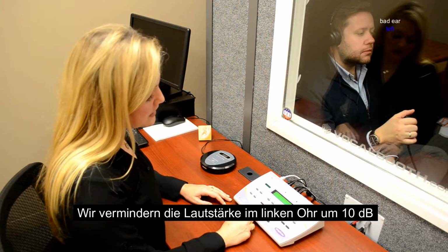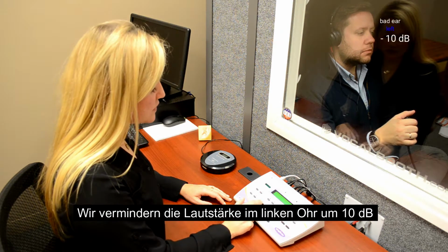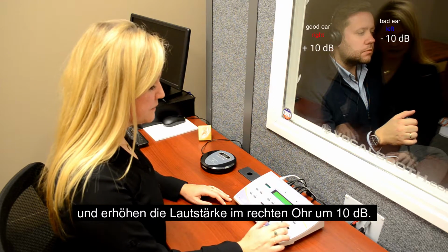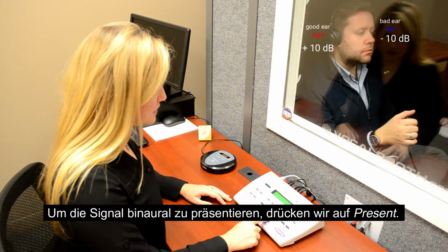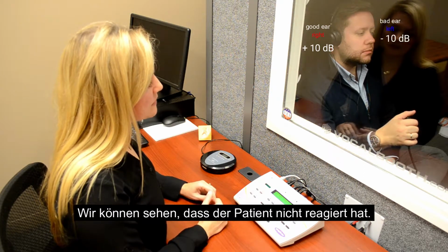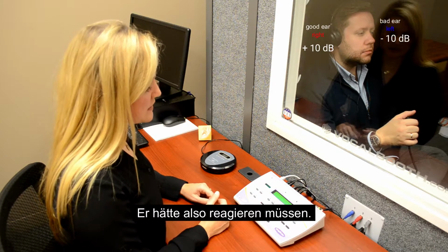So what we'll do is we'll decrease the amount that he is getting in the left ear by 10 decibels. And then on the right side, we'll increase it by 10. And then to present it, all you have to do is press the present button and it will present to both ears. As you can see, the patient did not press the button, so we know that he's hearing it in at least one ear, so he should have pressed the button.